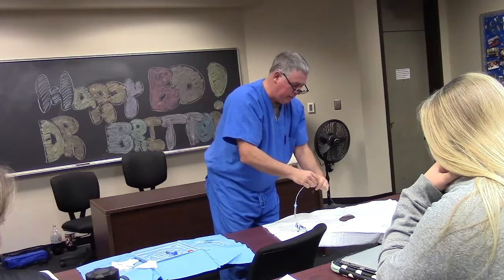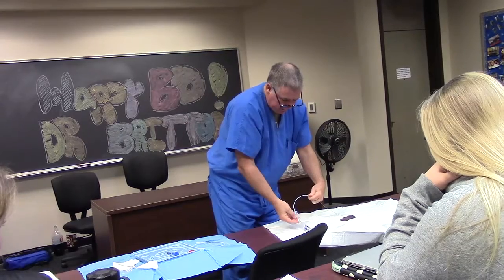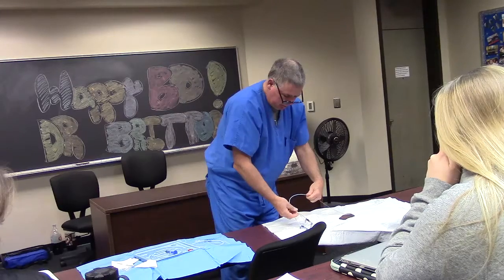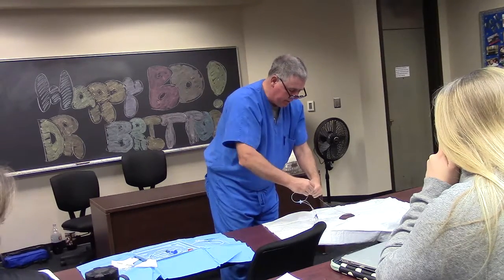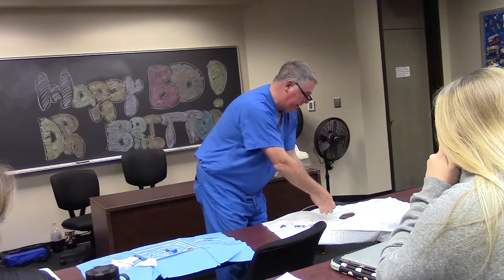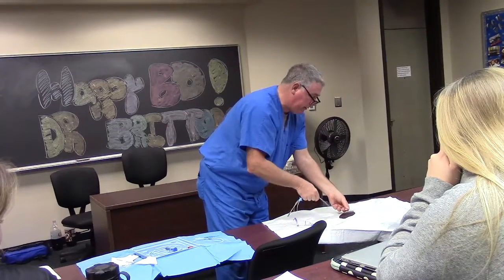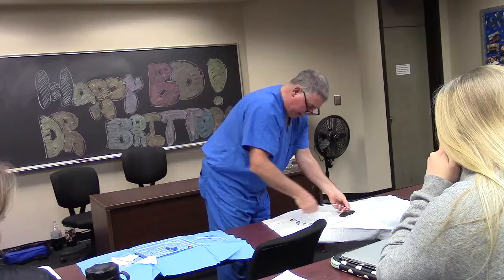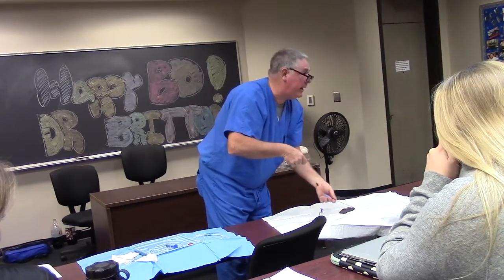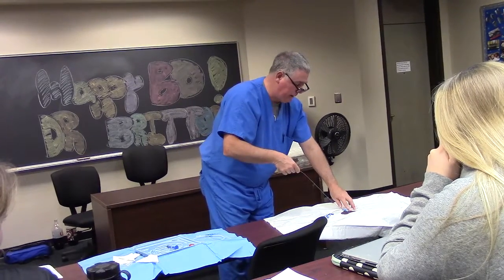Again, without letting go of the wire, you take the middle catheter here, remove the cap, and then just thread it on in. See, I'm not letting go of the wire. You have to always consciously note that. When the wire comes out the end, then you can grab it from back here and start threading it in like that. Take it all the way down to the hub, okay?